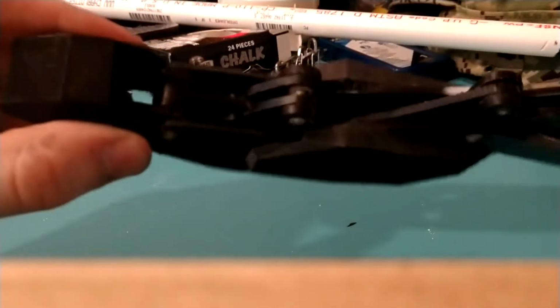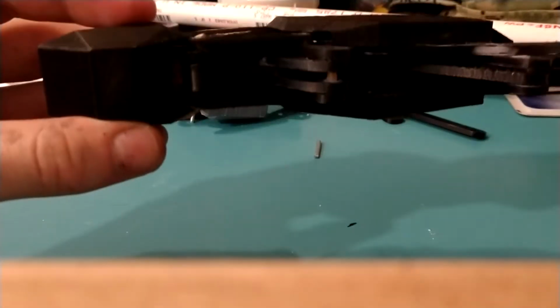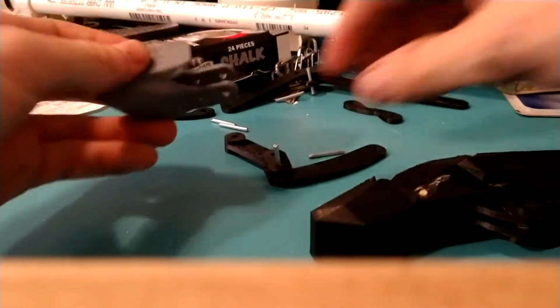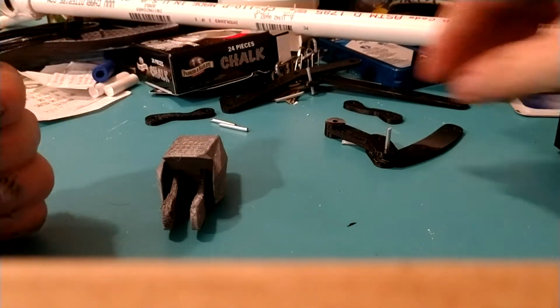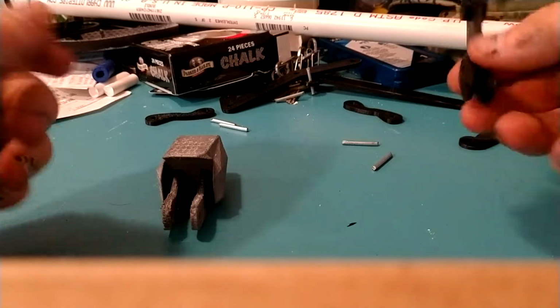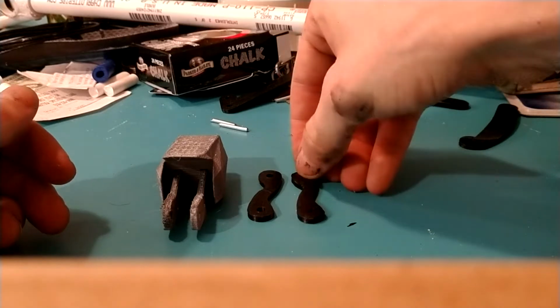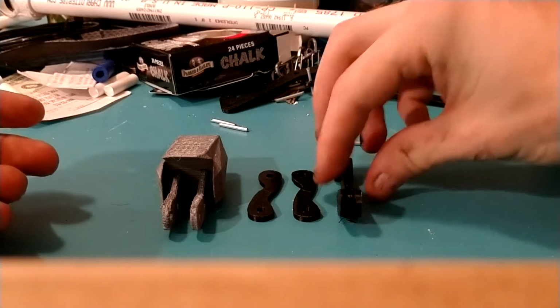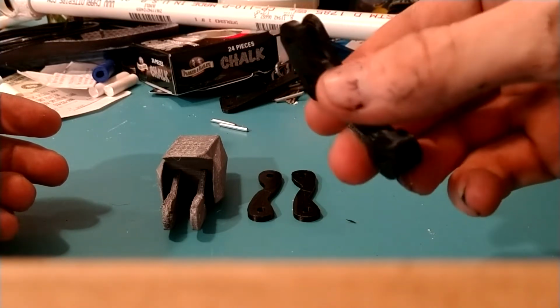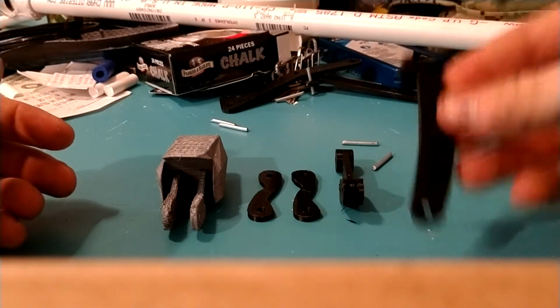Now, if you do notice, there is actually a bit more. So the whole thing that I did show you, that was only one side. You're going to basically replicate it on the other side. So in order to build a finger, you're going to need just the linkage part. You're going to need the fingertip. You're going to need 2 finger extenders, is what I believe I called them. Fingertip extenders. And then you're going to need 1 mid-finger bar. The mid-finger bar is the one with this notch in it. And then I believe you're going to need 1 of these.